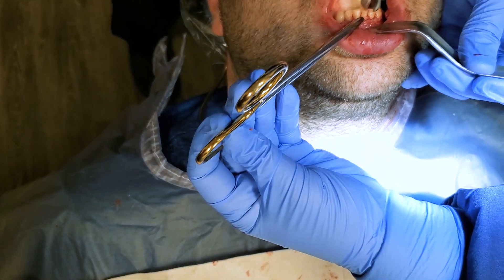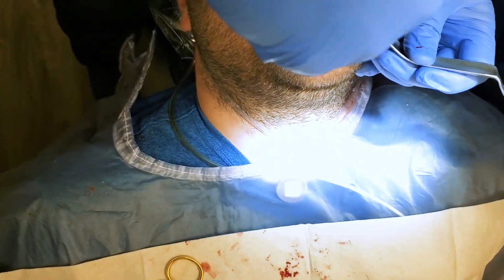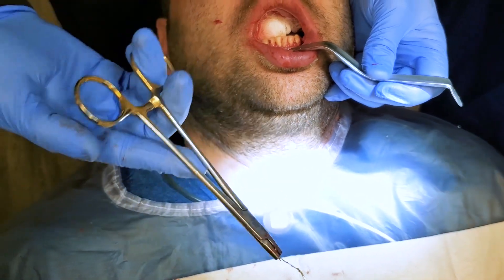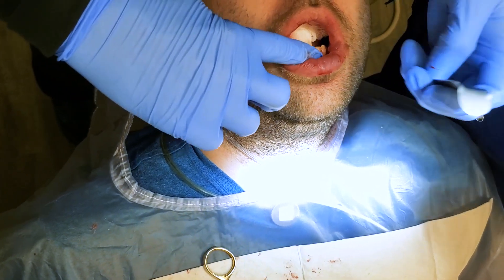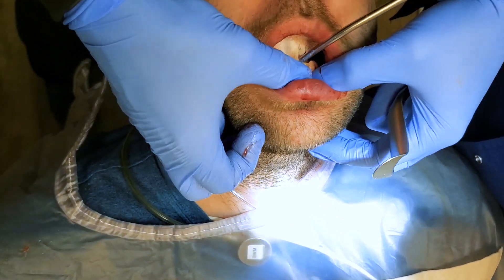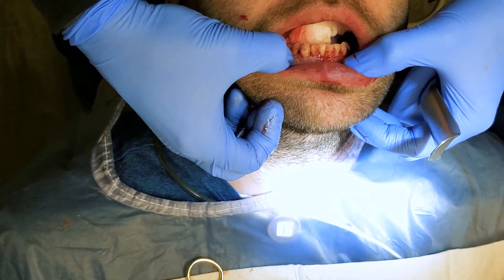Then I'll get a wire cutter and snip this wire. Just going to kind of pull — and there's the wire coming out like that. Now that's going to feel nice — you can almost hear the gums taking a nice deep breath, a sigh of relief. You'll heal up and do really well.